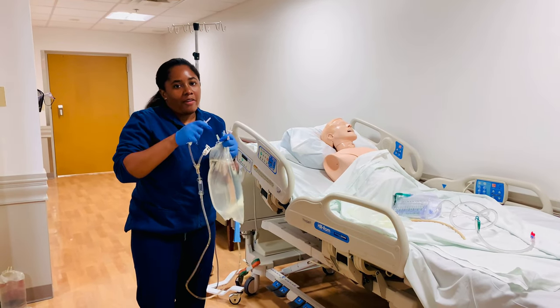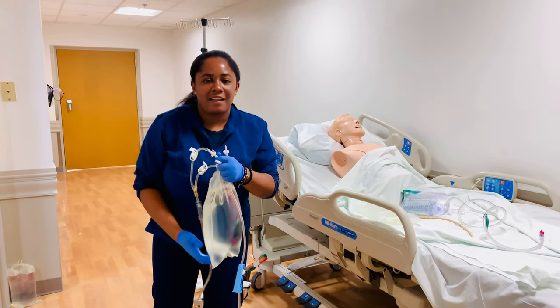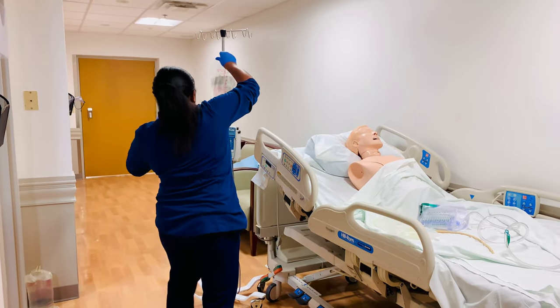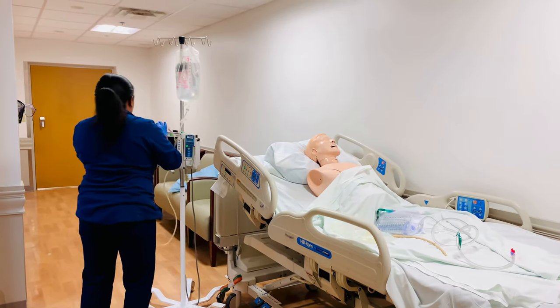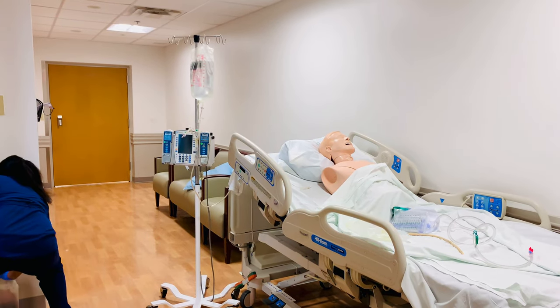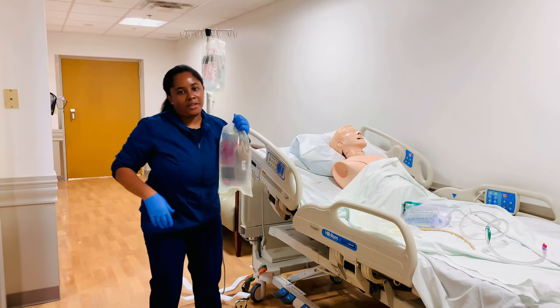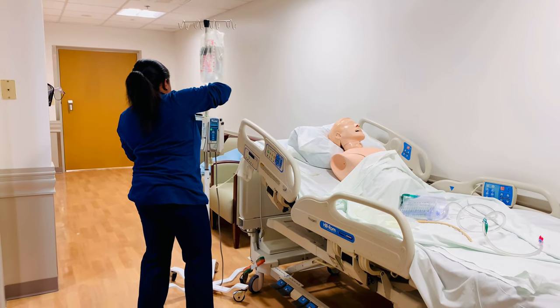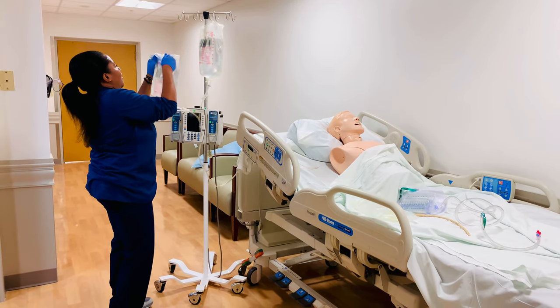I'm going to grab my first bag and go ahead and spike it. Then I'll grab my second bag — in practice it would be a brand new bag still in the plastic. I'm going to go ahead and spike my second bag as well. Just make sure everything is clamped until I'm done setting up everything.